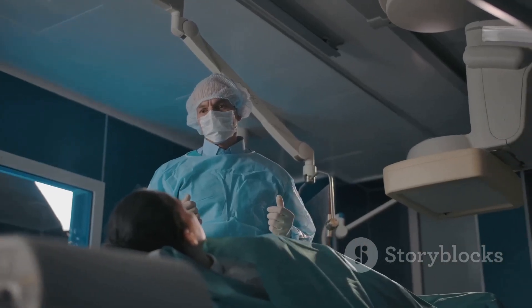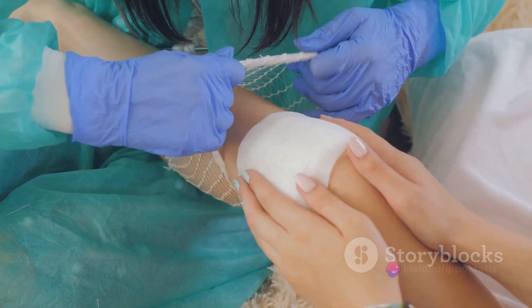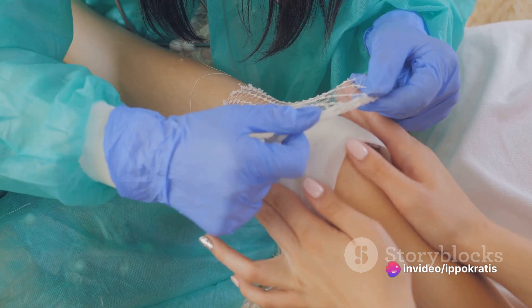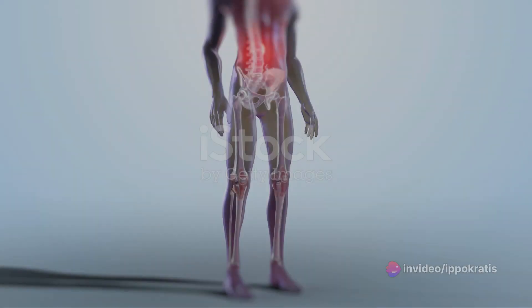Finally, the cement injection. Once the desired lift is achieved, the balloons are removed and the void created is filled with a special medical cement to maintain the new form of the vertebra.